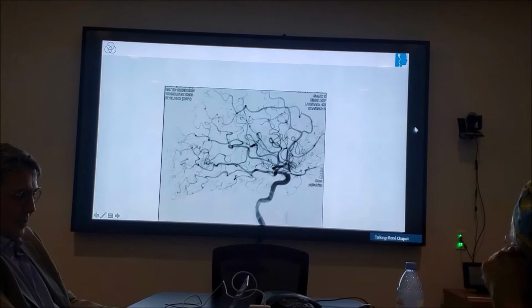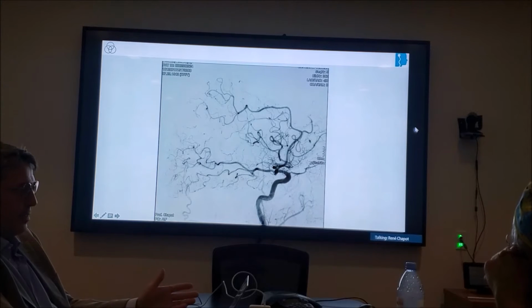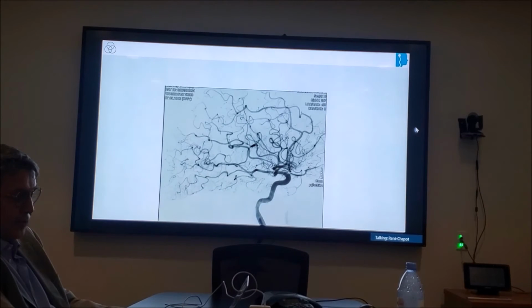The inferior is reopened too, but I go back to the previous image. Between this here and there, obviously we lost some clot in the ACA. So it's an ENT, embolus in a new territory. It's a problem that we created, displacing the clot from one branch to the other one. Now it's getting better, but an important part of the frontal lobe is still missing.